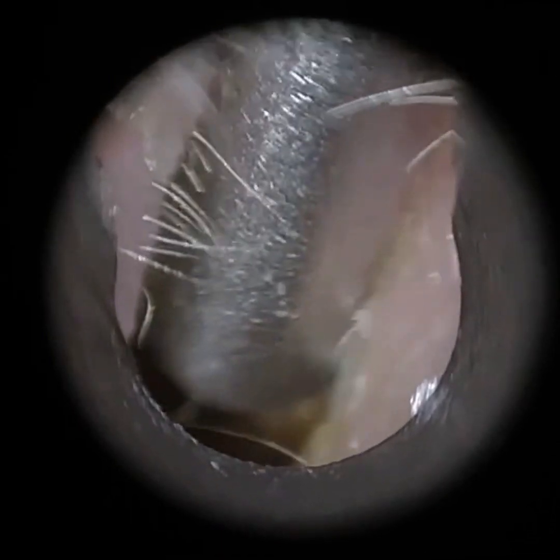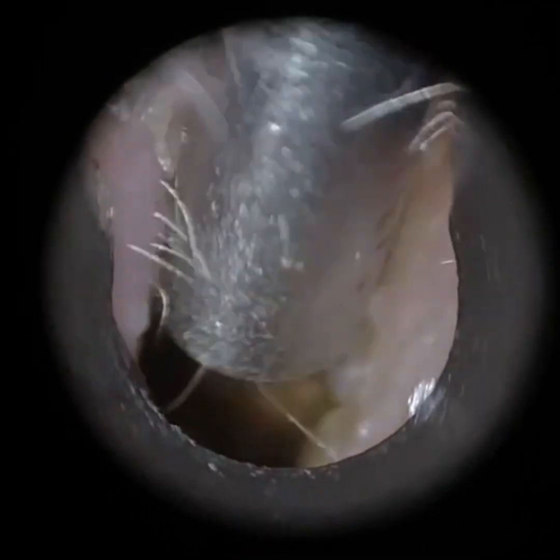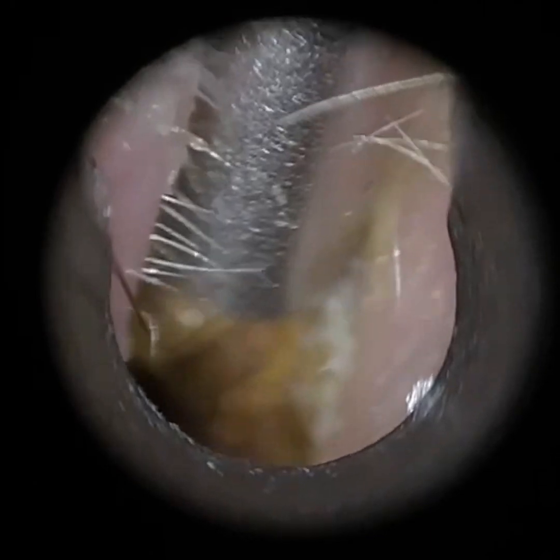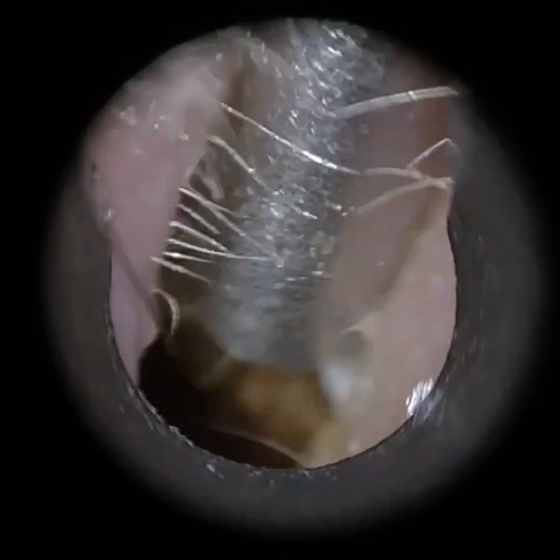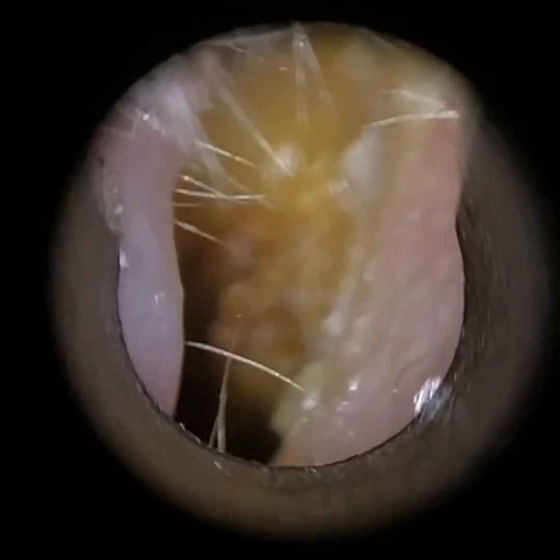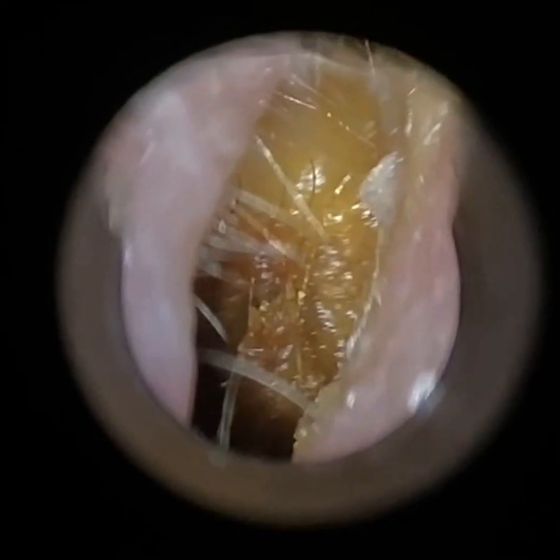He explained he had a procedure today with a particular patient who has got extremely narrow ear canals, as you can see. He initially used an endoscope, but found it quite understandably tricky to dilate the ear open with the endoscope, given how narrow it is.